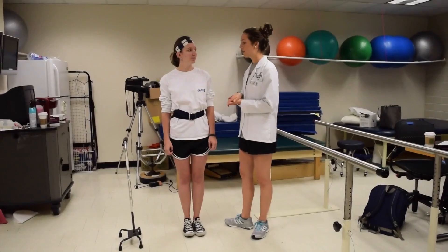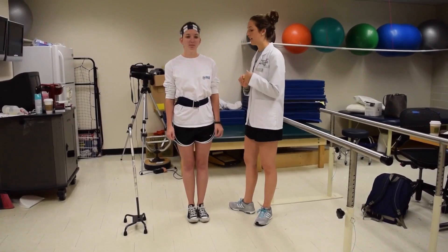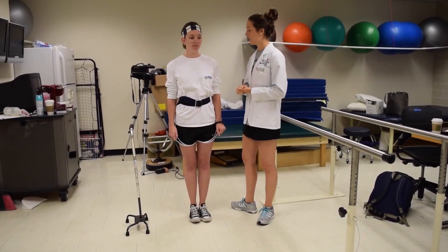We are back with Courtney for the second part of our session. We are going to talk about proper fit and basic ambulation with a cane. Specifically today, we are using a four-legged cane. Courtney, are you ready to get started again? Yes, I am.